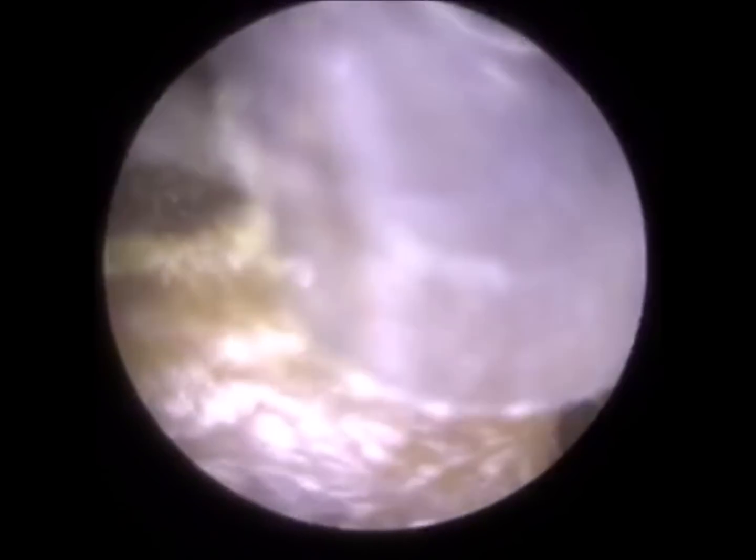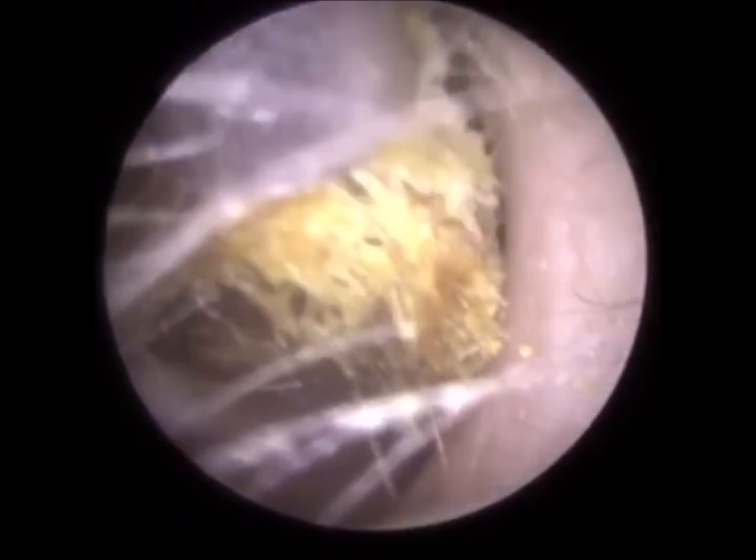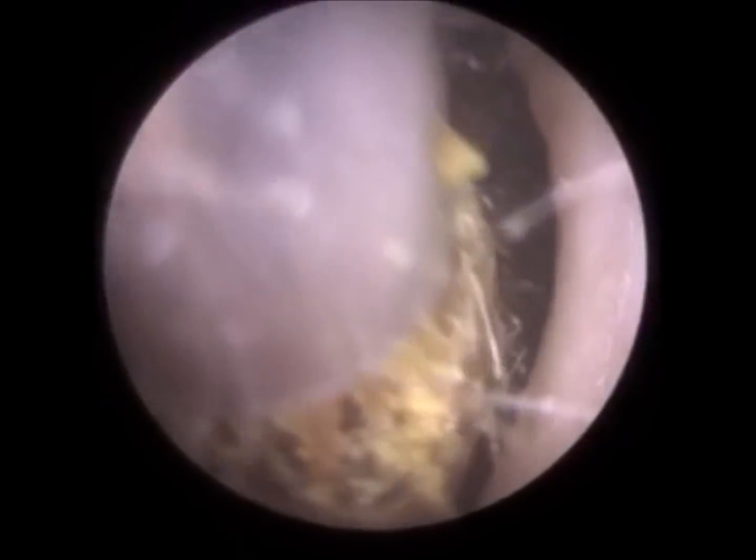This is the patient's right ear. They did admit to using Q-tips or cotton buds. You can see some of the cotton wool on the lateral piece of the wax, the wax that's facing nearest towards us, and you can see a lot of the wool fibres as well. You can probably see that just there where I'm suctioning now is a bit of cotton wool fibres. This wax is a bit more dense, a bit more heavier.